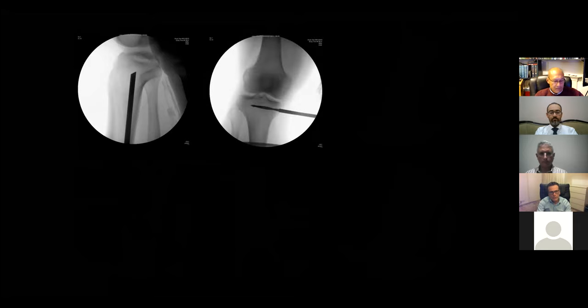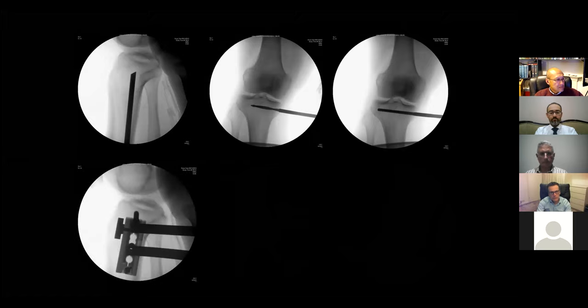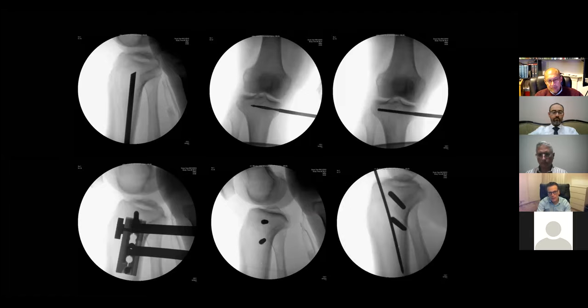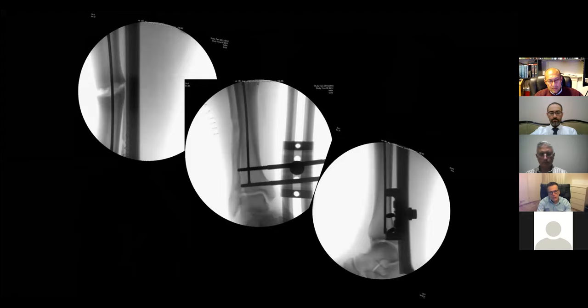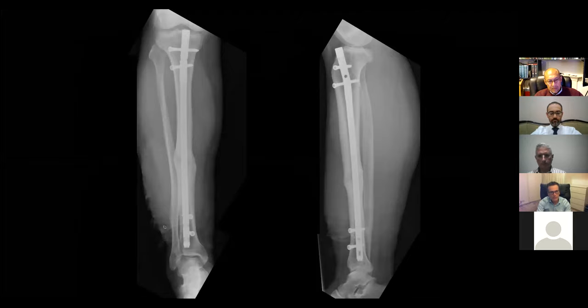Higher up, we are aiming to place our proximal pins. Again, the method is the same. You look at the profile of the clamp and the posterior axis of the tibia, which are collinear. So this way, we have placed the pins posteriorly to the entry point of the nail and the trajectory of placement of the nail. The osteotomy has been performed. Manipulation of the pins prior to insertion of the nail, and nail insertion in a satisfactory position, and correction of deformity has been achieved.